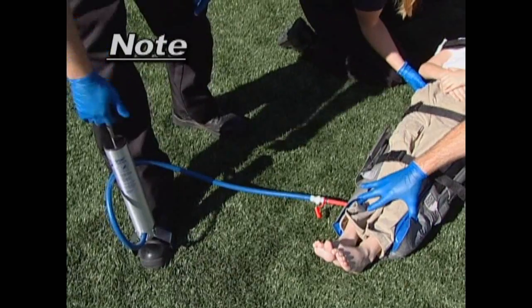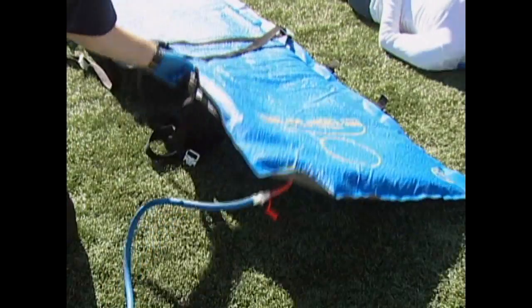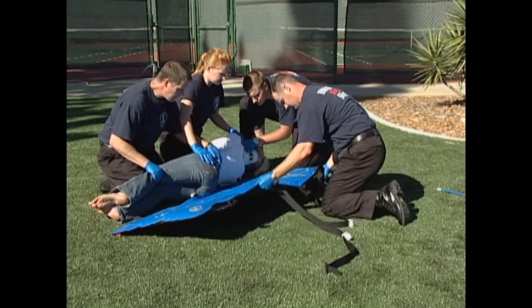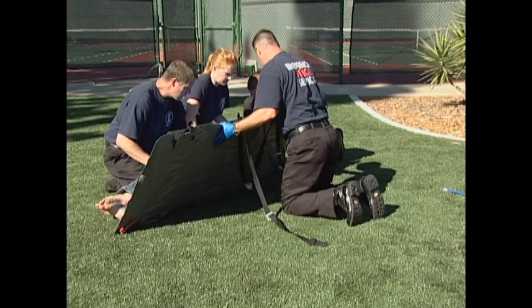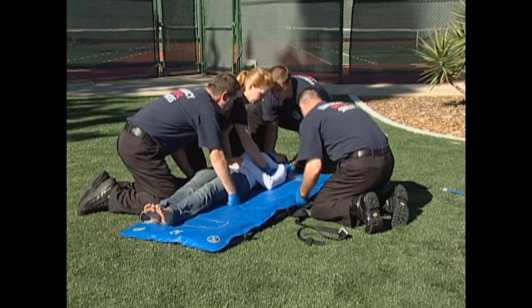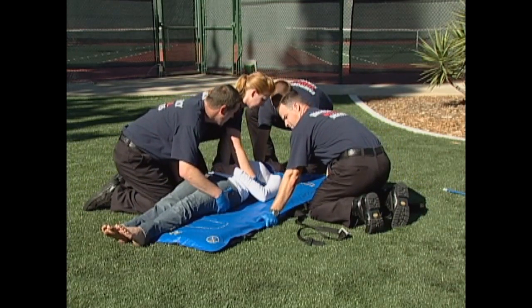Note: the pediatric Evacusplint mattress only has one valve at the foot end of the mattress. Evacuate enough air to make the mattress semi-rigid. The objective is to be able to move the mattress as a unit during positioning and have the beads stabilized enough to place the patient onto the mattress without pushing the beads to one side. With the correct amount of evacuation, the mattress surface should be smooth but not excessively dimpled.